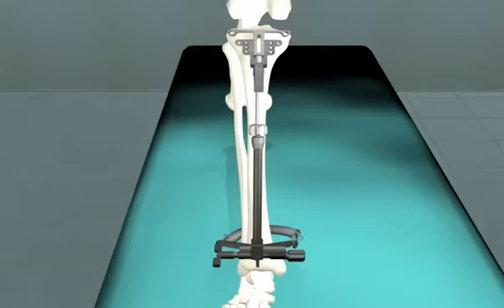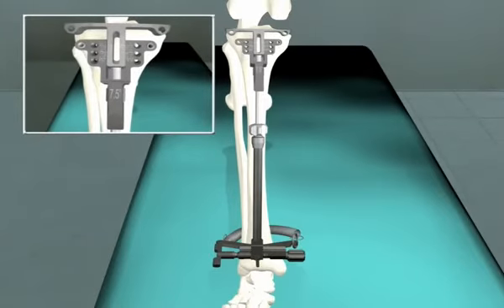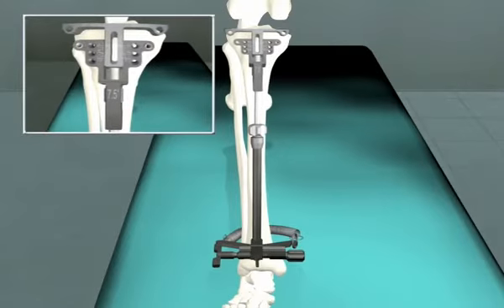Once the strap is connected, the proximal portion of the guide can be raised or lowered using the alignment rod, and the guide should be placed in the frontal plane to be perpendicular to the frontal plane axis.